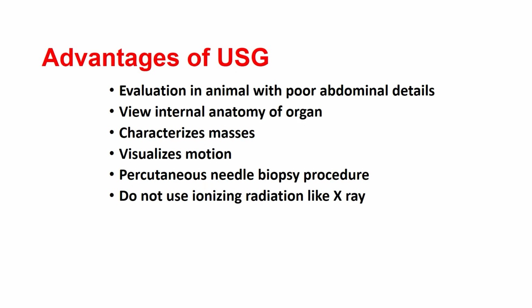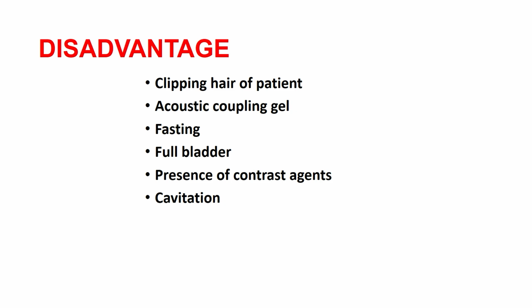We can visualize the motion of movable organs, for example, heart, intestine, etc. We can also take a biopsy. The most important advantage over X-ray is that it does not have any ionizing radiation, so it is very safe to use in pregnant animals. So, these are certain advantages of ultrasonography.